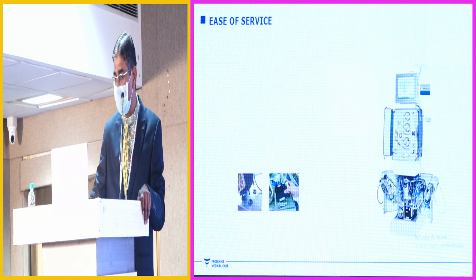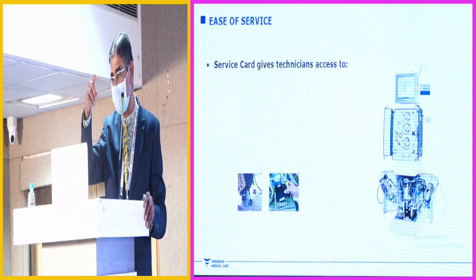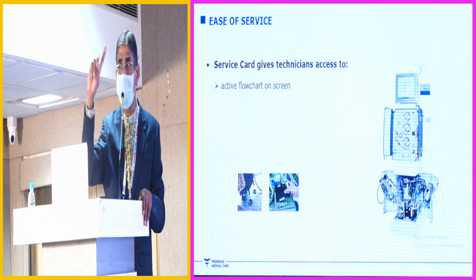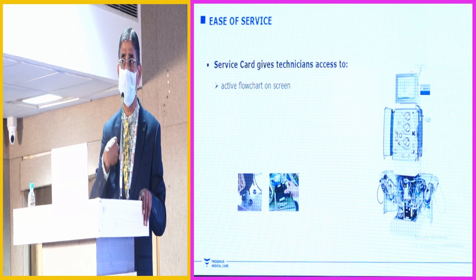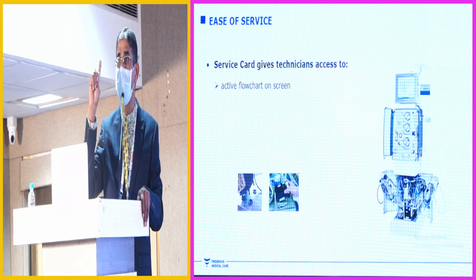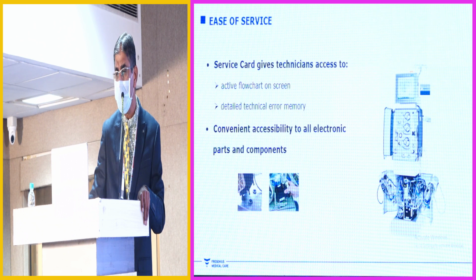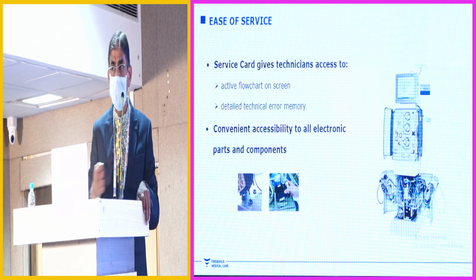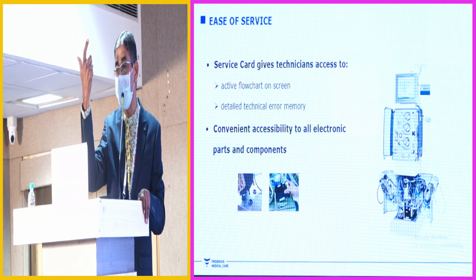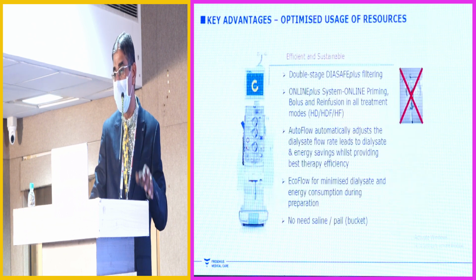Easy to service, yes. You need to only pull the hydraulics. This is more for the engineers, as Sir said, Professor Lober rightly remarked, you need to have a service card. Without the service card, you can't do. Like I am a trainer, country trainer for most of the machines, and I have my own user card. I also have the service card now, recently got it. So when they remove it, they can go into which valve, where, which function has malfunction. They can know it, but then the correction is from their end. They have to do it manually only.